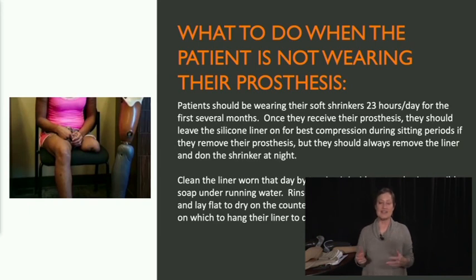Also on this slide, it talks about how to clean your liners. Patients always get two. They should wash one, wear the other one. And they also get specific instructions from the prosthetist about how to clean them. If a patient's skin is looking problematic, it's almost always a hygiene issue more so than a true reaction to the material in the liner. That material is inert. So either they're not washing their skin well, or they're not washing the liner well, or both, or maybe they need to use some kind of lotion at night as well. Great topic to talk to the prosthetist about as well.